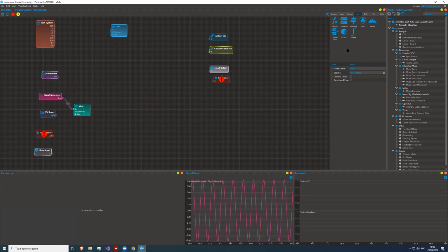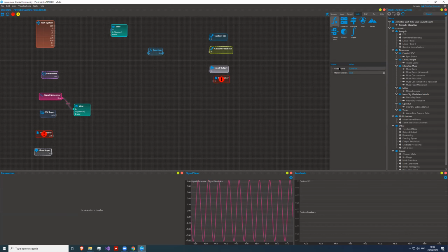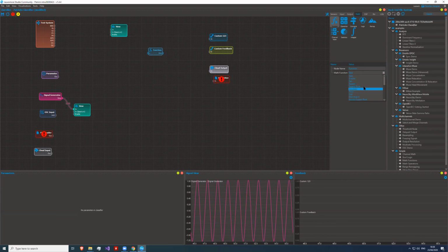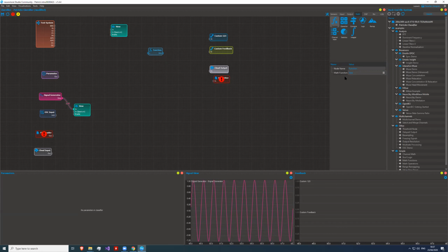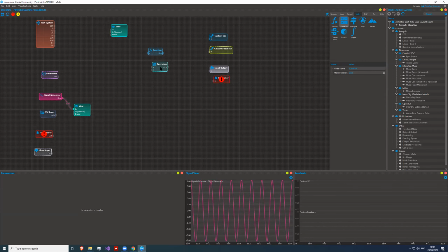All right, then in terms of operations that can be done, we have mathematical nodes. We have a mathematical function, sine, cosine, whatever. It's all the mathematical functions that we have come across so far and that have been needed.